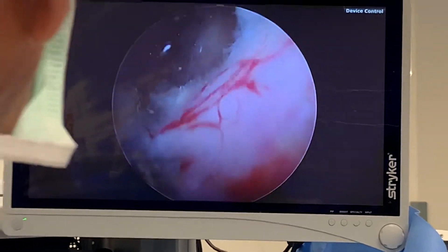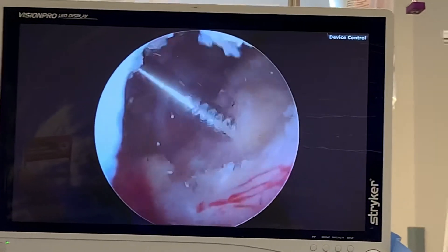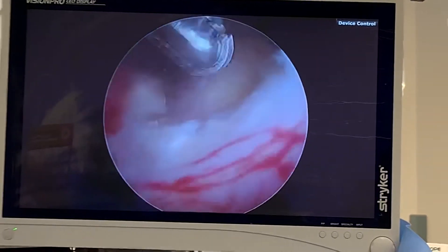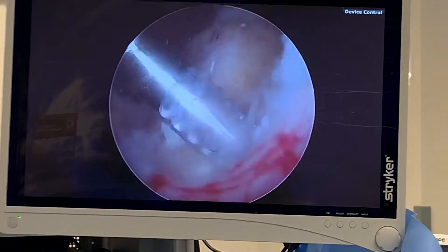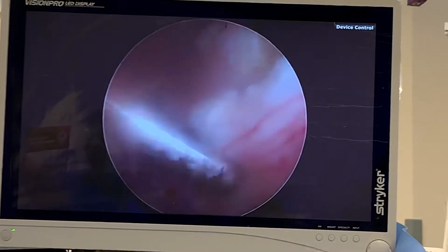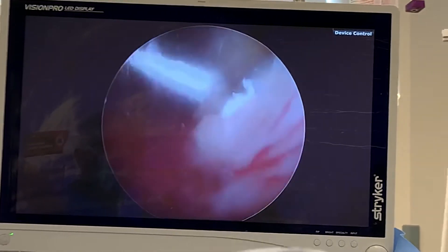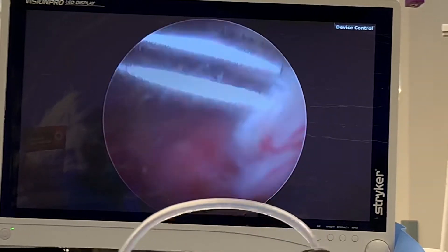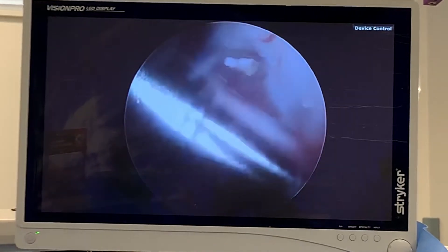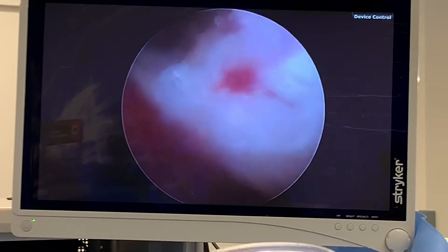Tendon right there, and towards the back of the rotator cuff. I'm going to go in here with this roto-rooter type of device, or the shaver type of device, and suck out those fragments. I'm going to suck them all out, because otherwise it's going to irritate the shoulder after surgery. It's very vascular — the body was responding to it and it was getting irritated. There's some more right there.